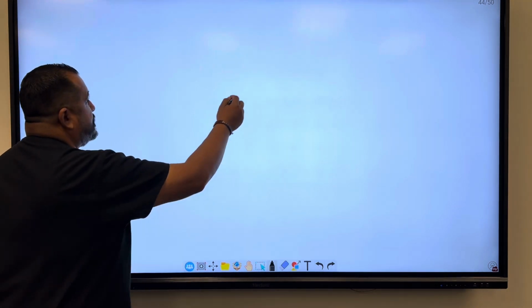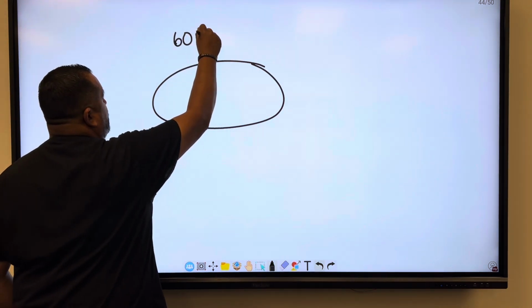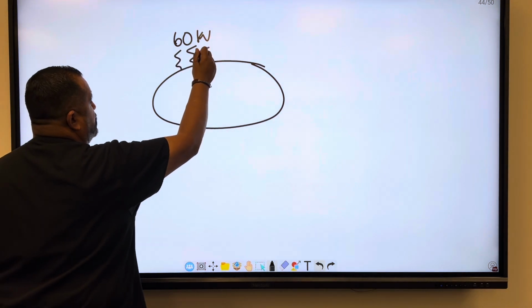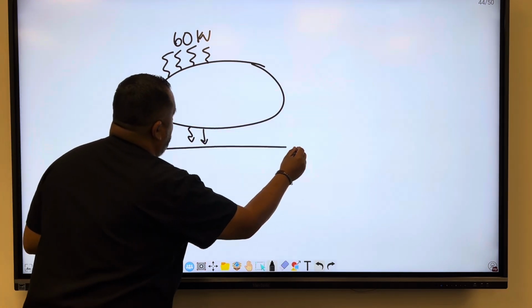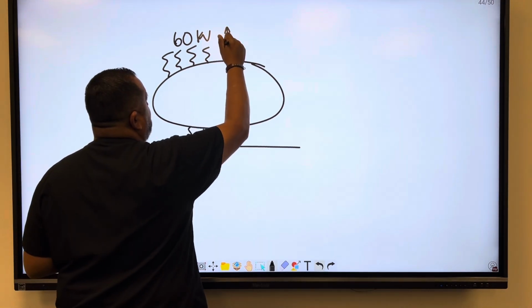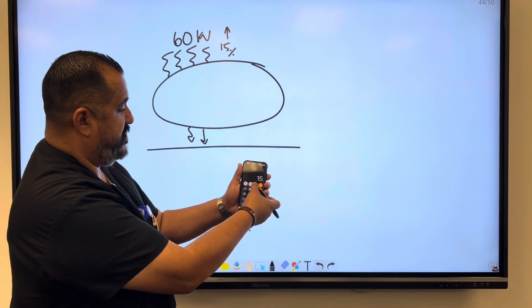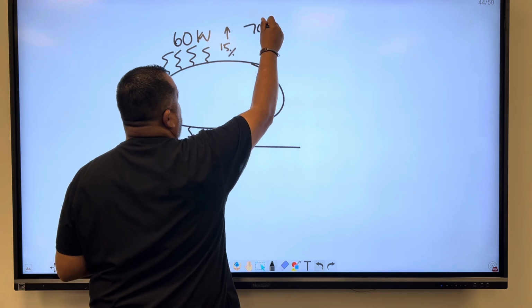So let's say this is the body part. You make an exposure at 60 kV. And now I'll get my calculator out. You have X-ray photons going to the part, and let's say 2 photons go through. All right. Now, if you go to 15% more, so let's say we increase it by 15%, we're going to go ahead and go here to 60 plus 15% is 9. So now we're at 69 kV. Well, we're going to round it. We're going to go to 70 kV.